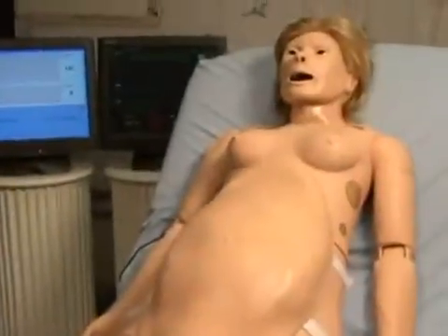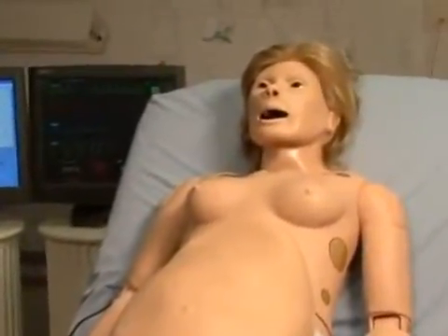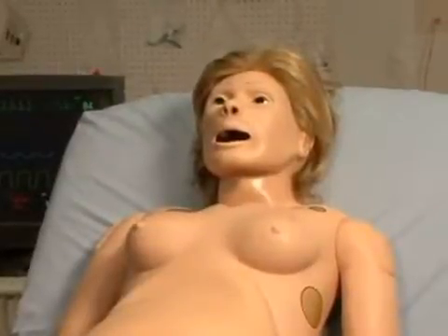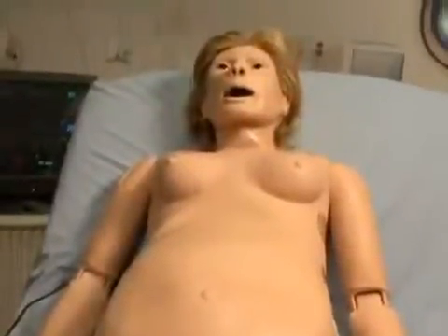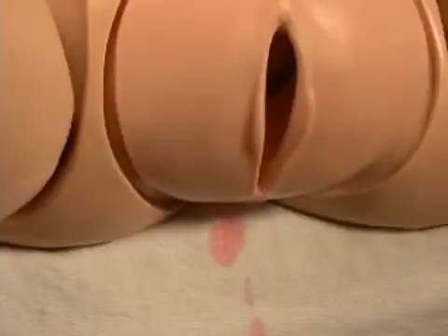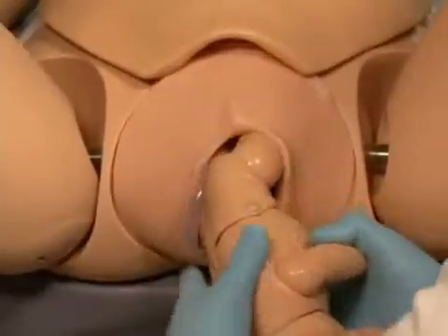Now that your NOEL Total Mobile Solution Simulator is ready for use, let us take a tour of her many features. NOEL allows one to superimpose any number of issues, such as airway, breathing, circulation, or trauma issues, on top of normal or difficult deliveries.